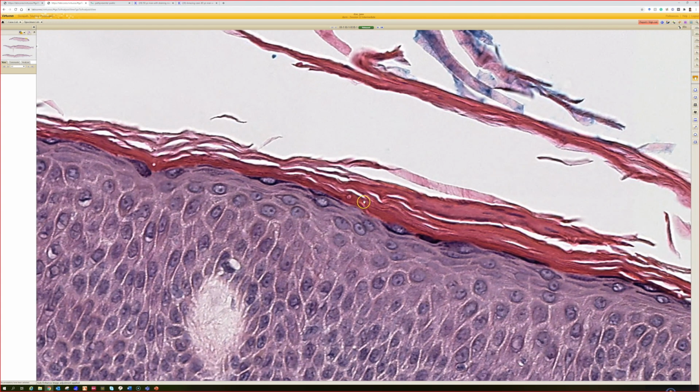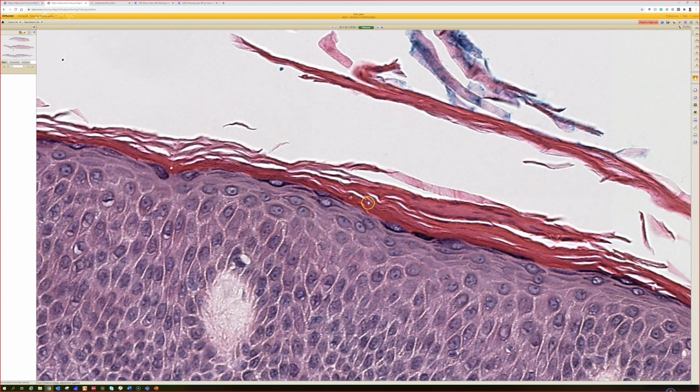And look, it's pretty hard to see. Some of these slides, of course, are going to be hard to see because we're looking at very small things. There's a little tiny circle there with a little dot in the middle of cytoplasm. That's the cross section of the fungal hypha. And here's another hypha right here that's running kind of longitudinally. And you might be like, really?